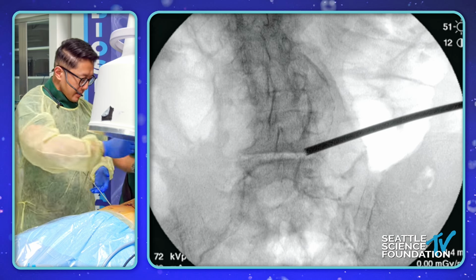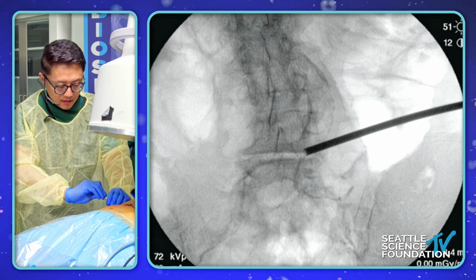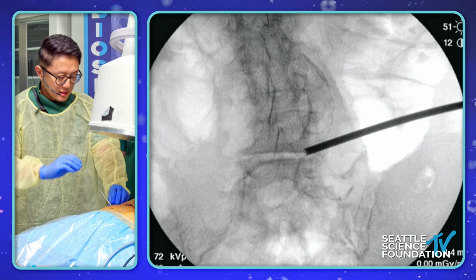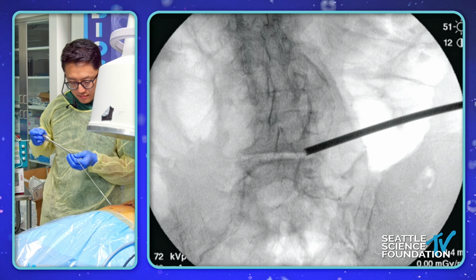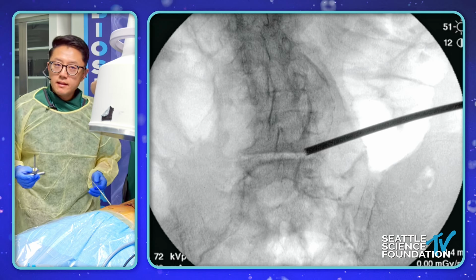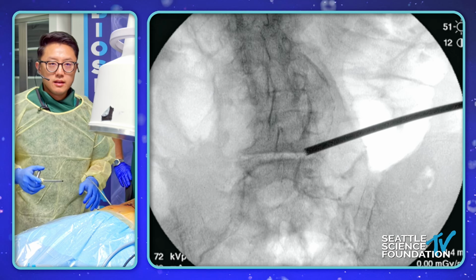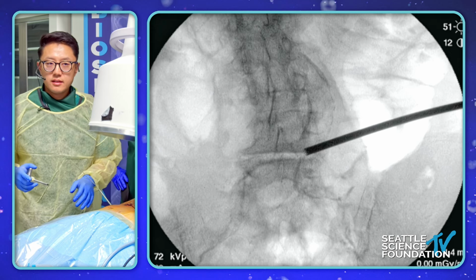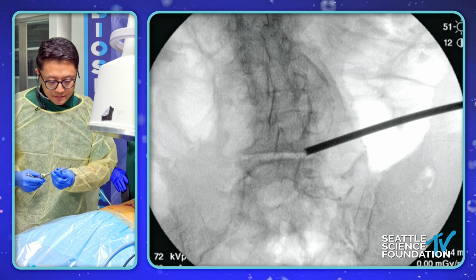Then we're going to take out, and just to elaborate on your approach, you said you're applying a little bit of downward pressure. As you're holding with your left hand, are you giving any pressure to the SAP by pushing your hand a little bit down towards the ground to more engage the SAP, or are you just putting forward pressure? Yeah, that's an excellent point.